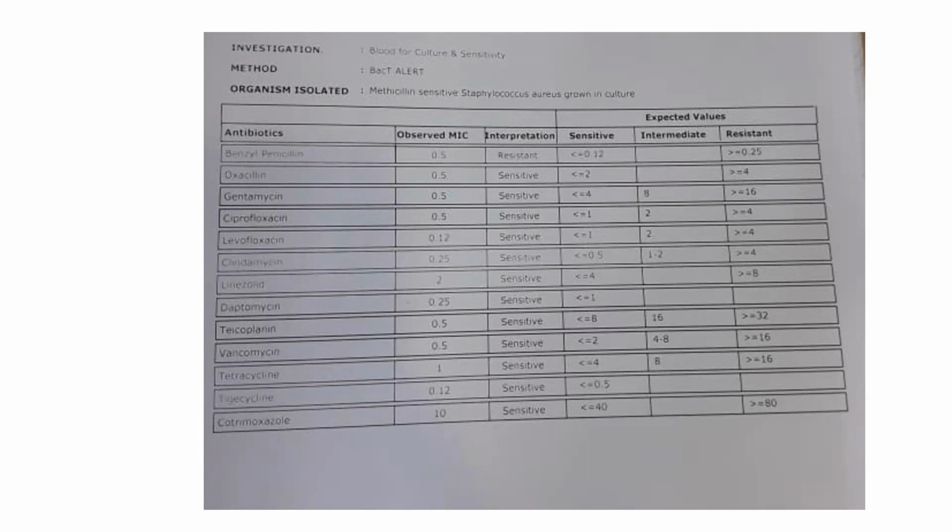Okay. And then, sir, last question again in this report only. So now I have got all these antibiotics and I have got all these MICs which are listed here. So my guess is this report is generated from probably a Vitek or a Vitek kind of machine. That is my guess, because I don't think, or please correct me if I'm wrong, that these reports are coming from disk diffusion, or from your E-strip, right? Is that the correct information? Correct. This is by the Vitek.